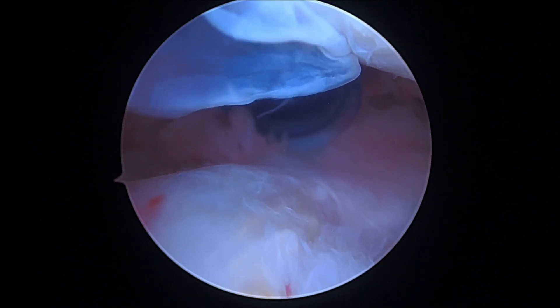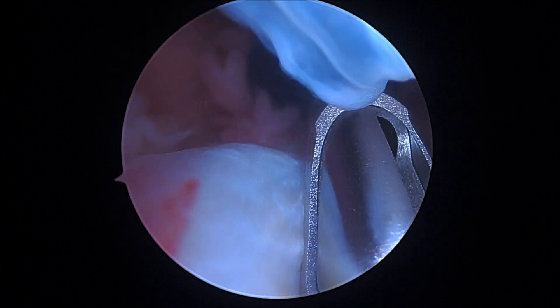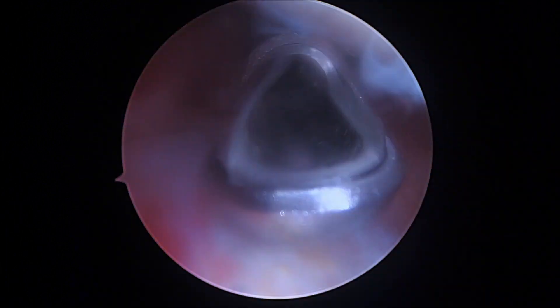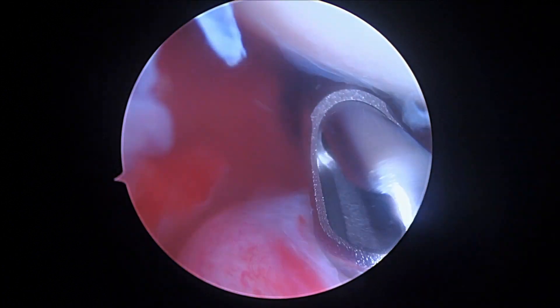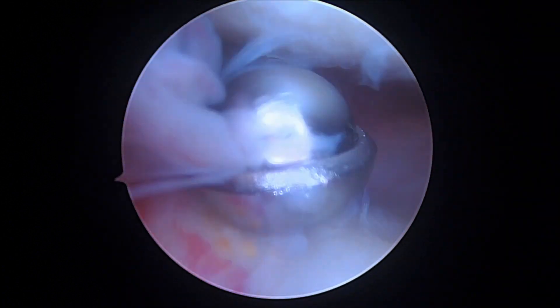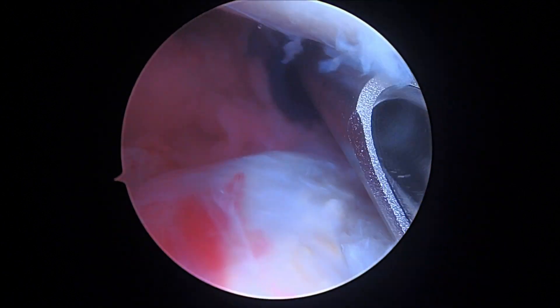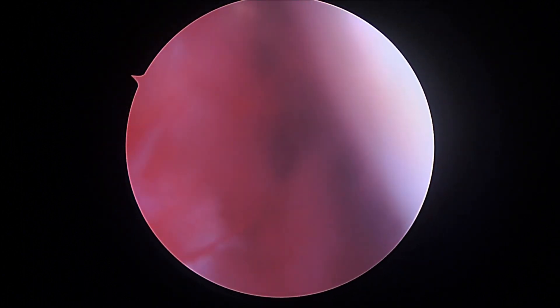Okay, hi there. It's Dr. Buford. We're just getting started on the right shoulder. We're looking in from the back to the front, just like we showed you before, and right now we're just using our shaver to try and get a good look inside the joint here. I don't see much different.